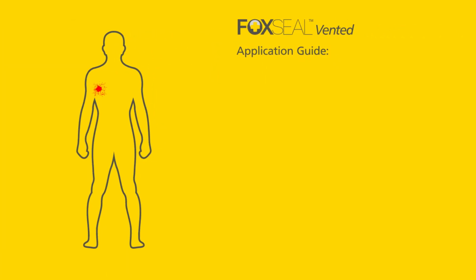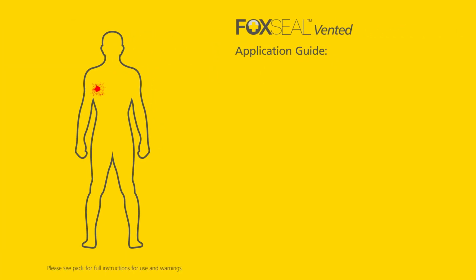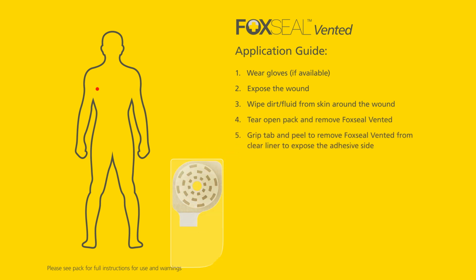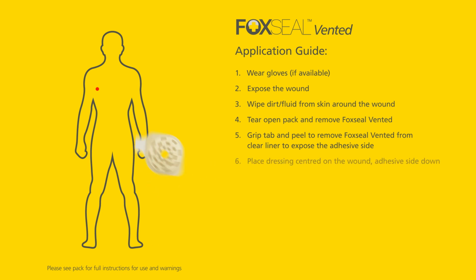Remember to follow these steps when applying Foxseal Vented. Wear gloves if available. Expose the wound. Wipe dirt, fluid from skin around the wound. Tear open pack and remove Foxseal Vented. Grip tab and peel to remove Foxseal Vented from clear liner to expose the adhesive side. Place dressing centered on the wound, adhesive side down. Firmly press dressing to skin around wound to seal.